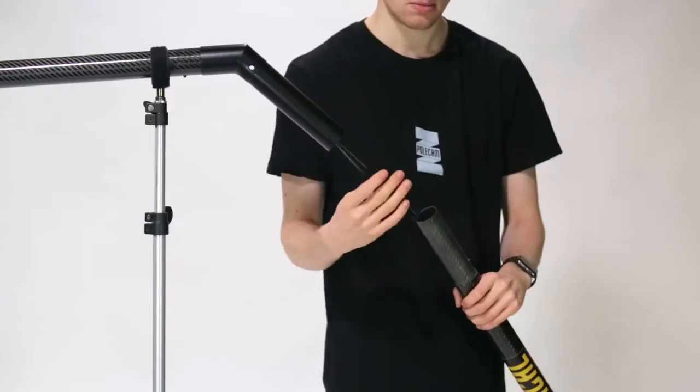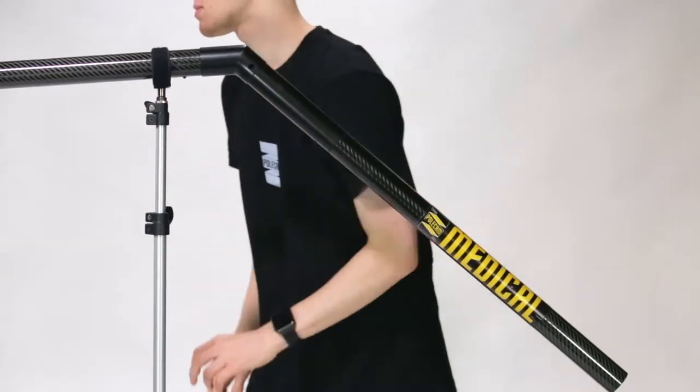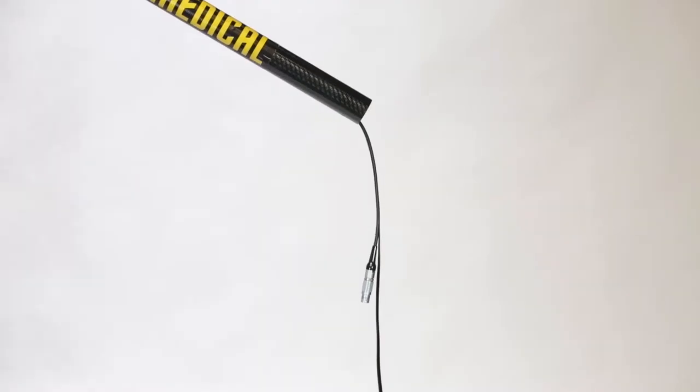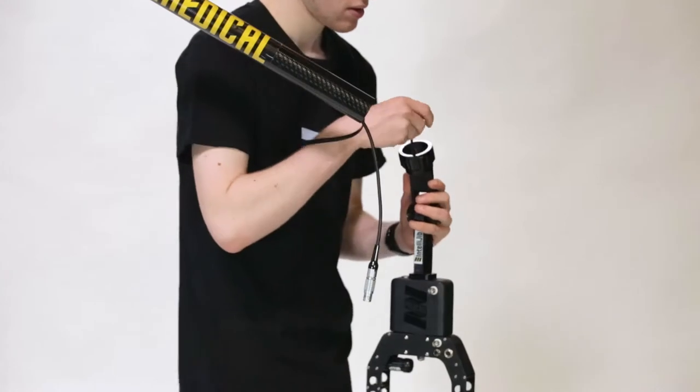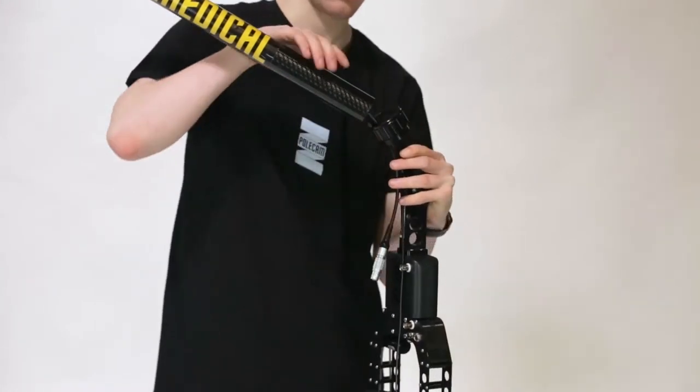You can now mount the half-length carbon fibre pole and move to the camera and head. Pass the cables through the hole and secure the head onto the end of the short pole using the rotating screw.